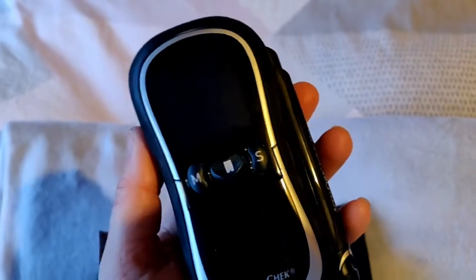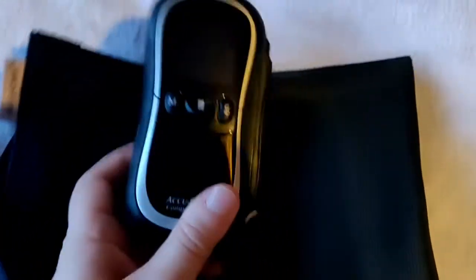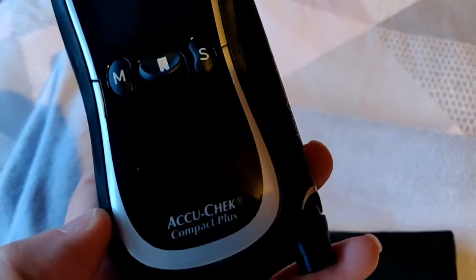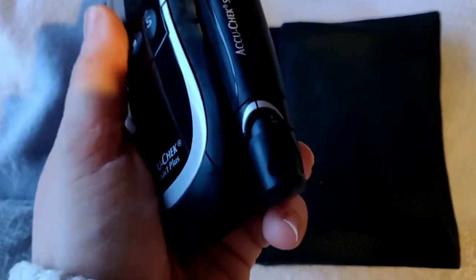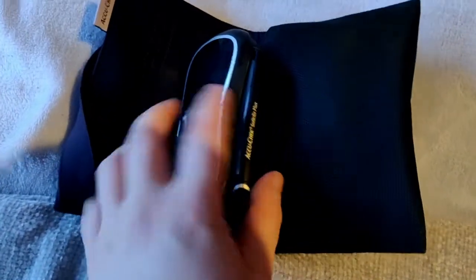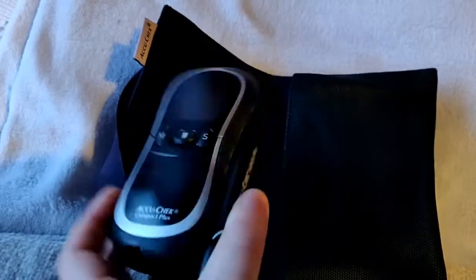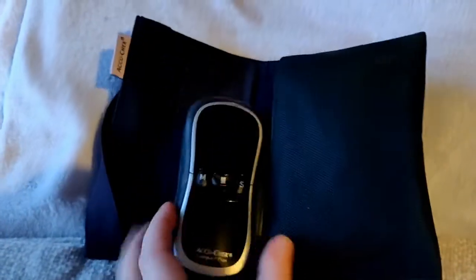I also found another random meter — the Accu-Chek Compact Plus. Honestly, I don't even remember using this. I was probably prescribed it to try, but it doesn't even turn on. It did have the FastClix pen built along the side, which was definitely an upgrade. It's a bit bulky compared to the others, but you can see it was moving toward having more of a screen. I really don't remember using this at all.